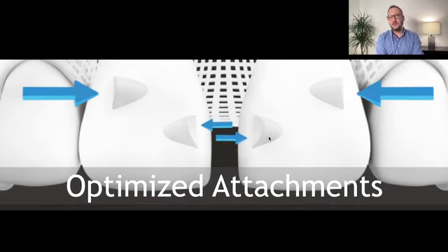And then you can start placing the attachments or changing the attachments for the system that already came with attachments. So by understanding the start point and the final position, you can clearly see the direction and the force that the elastic is going to provide. So then you will understand more easily if you need an attachment facing the big wall, the big surface, in which direction, okay? And then we have the optimized attachments, okay?